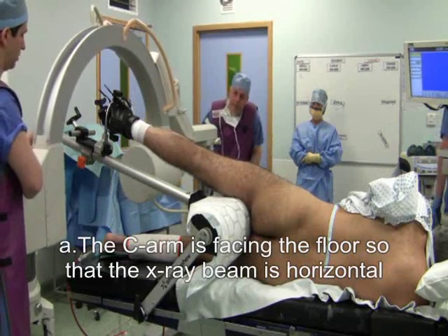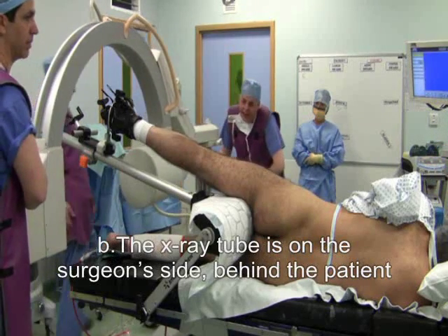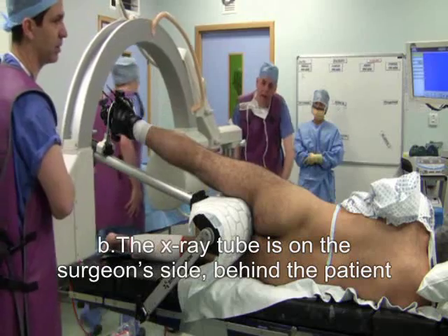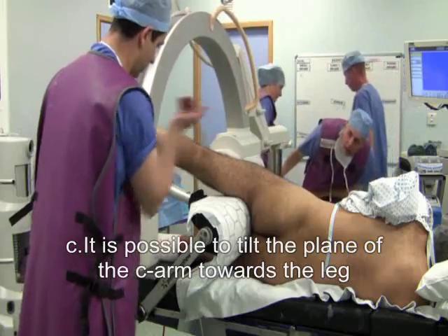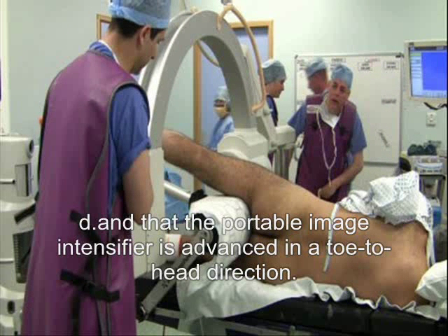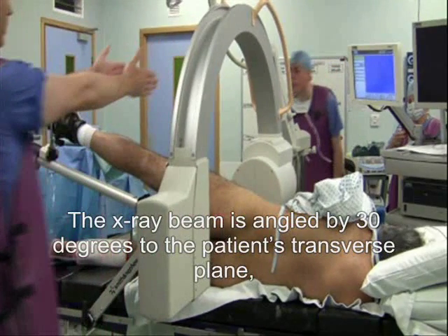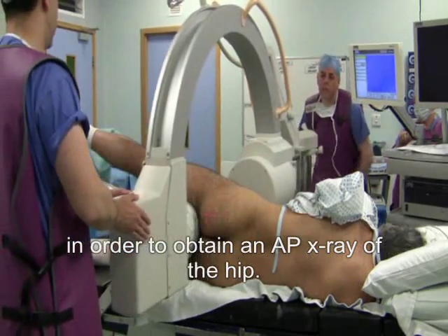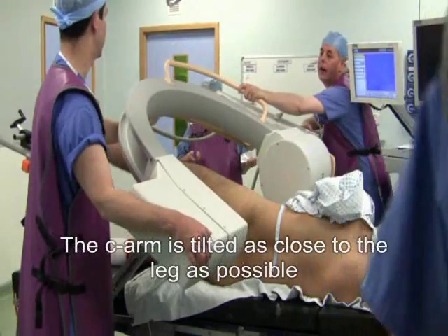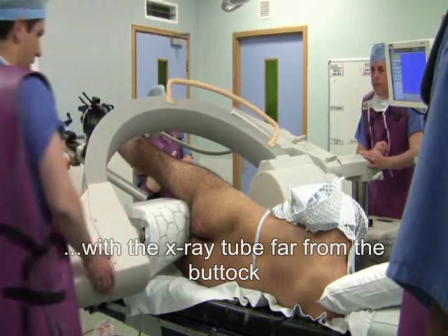The radiographer makes sure that: A, the C-arm is facing the floor so that the x-ray beam is horizontal; B, the x-ray tube is on the surgeon's side behind the patient; C, it is possible to tilt the plane of the C-arm towards the leg; and D, the portable image intensifier is advanced in a toe-to-head direction. The x-ray beam is angled by 30 degrees to the patient's transverse plane in order to obtain an AP x-ray of the hip. The C-arm is tilted as close to the leg as possible, with the x-ray tube far from the buttock.